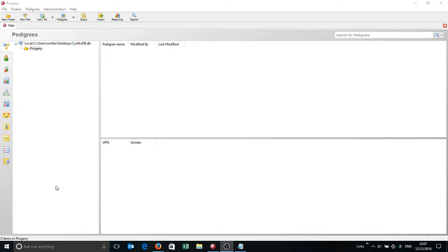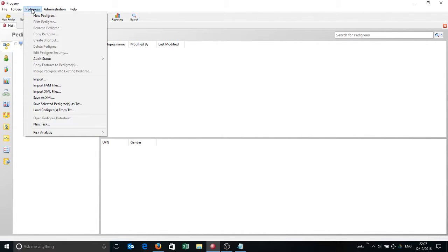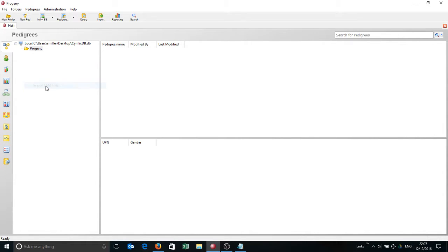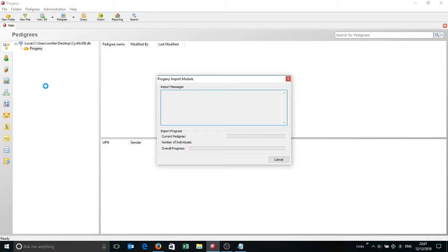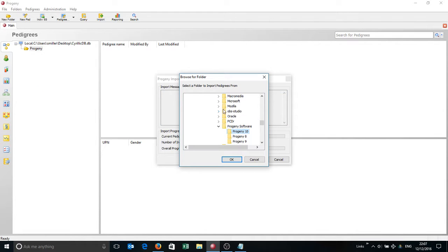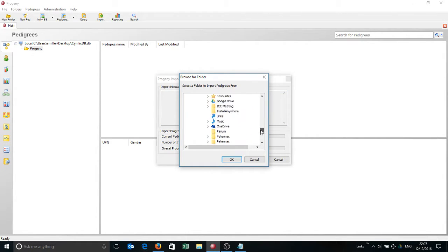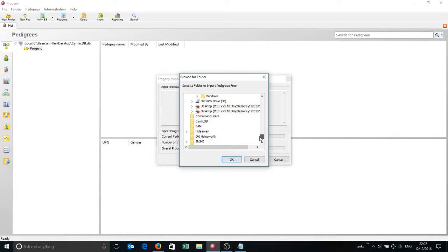I'm going to start off on the main screen, I'm on the Pedigrees tab, I've clicked on the Progeny folder. I'm then going to go up to the Pedigrees menu, left clicking, then going to go down and import some FAM files and then simply going to go to the folder where I've saved those FAM files.